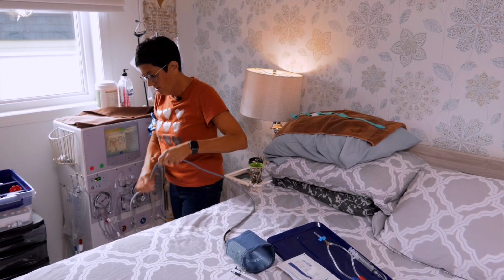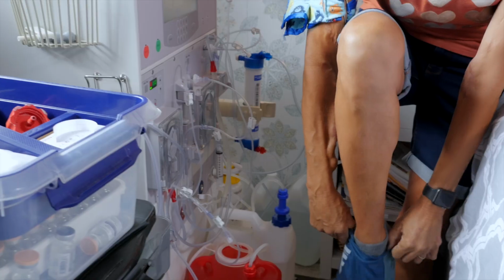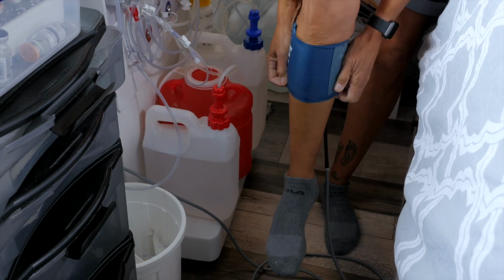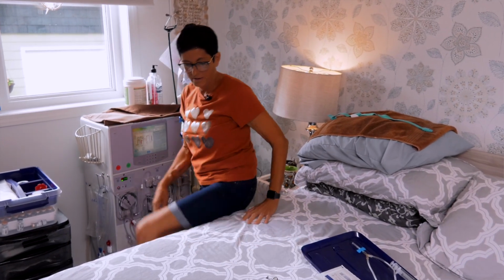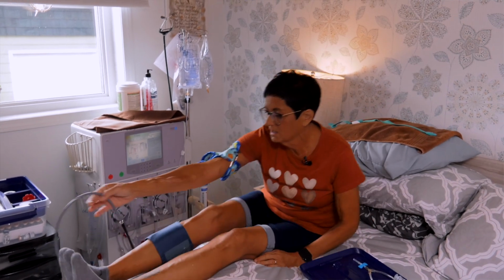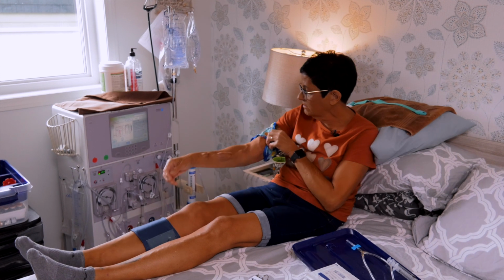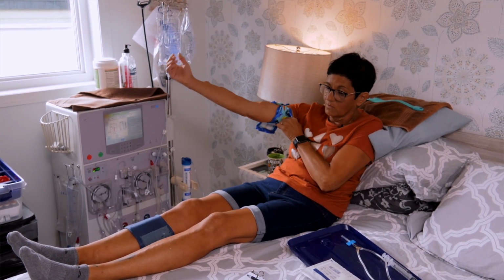I do my blood pressure on my leg because of the surgeries I've had on my arms. We want to reserve my arm. My surgeon doesn't want me using my arm because he wants to try and save it for another creation of a fistula. So I do mine on my lower leg, and I only do this one.